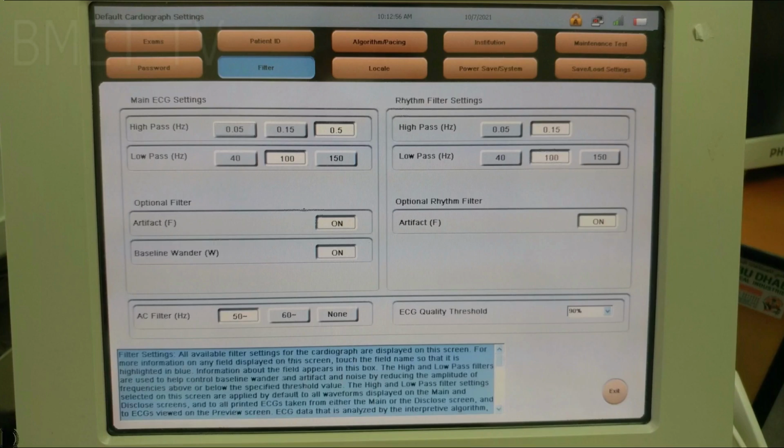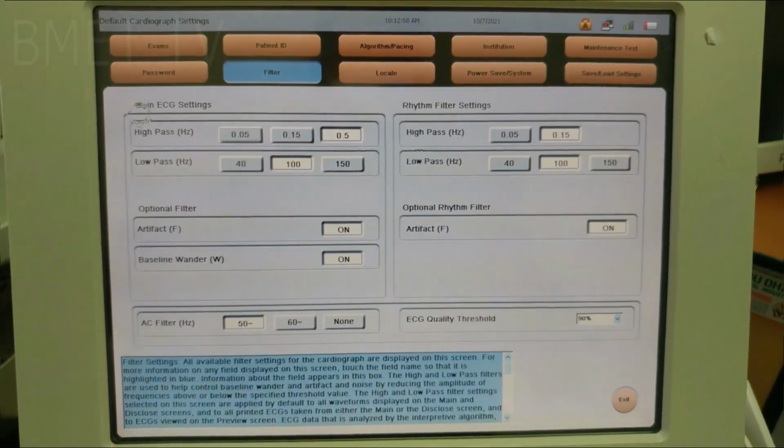The terminology associated with ECG high-pass filters can be confusing. While the filter is correctly termed a high-pass filter, it affects the low-frequency response, around the 0.05 Hz to 1 Hz region. So it is easy to get mixed up between high and low.